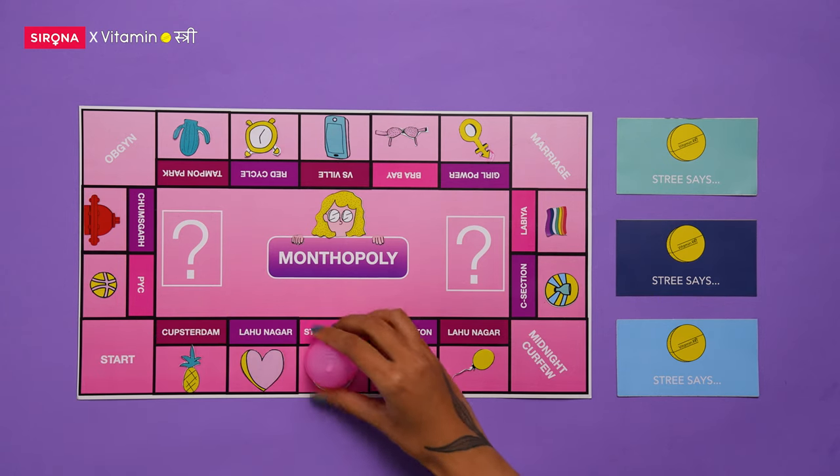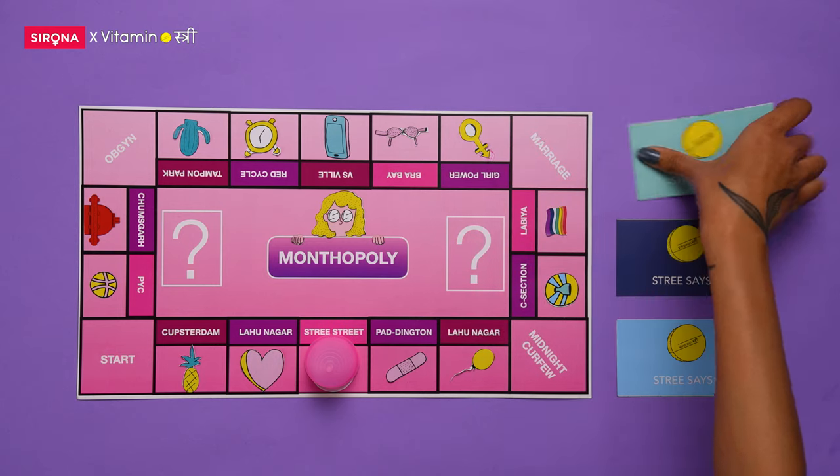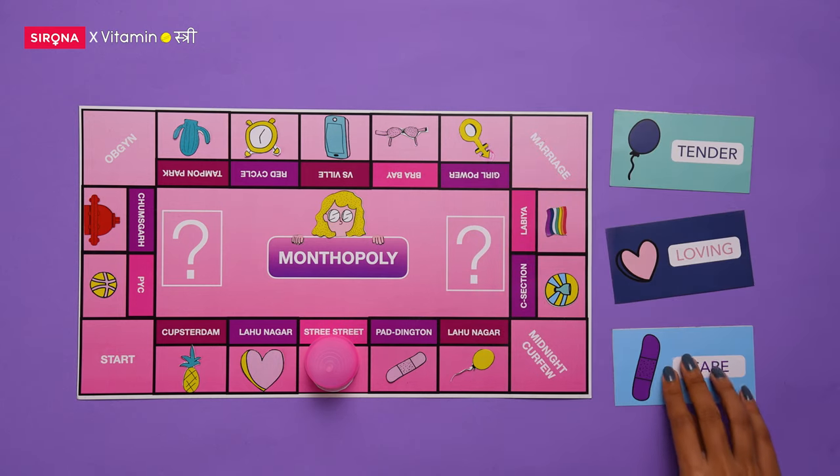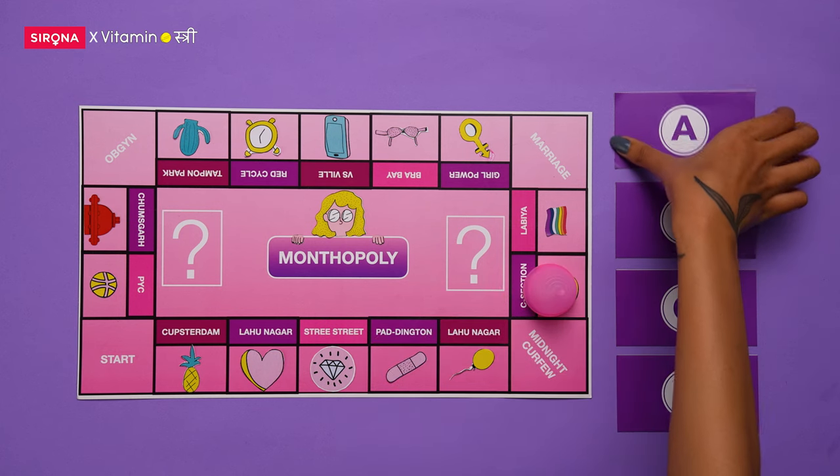A menstrual cup is like a long-term investment and the returns will only come if you do give it some good TLC. So, here are the ABCDs about how to take care of your menstrual cup.